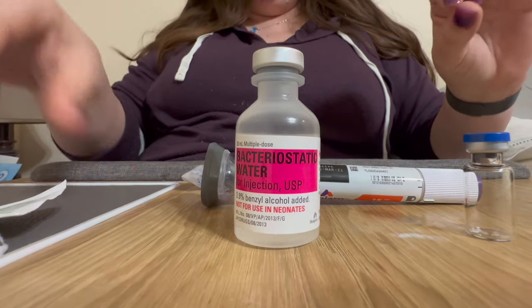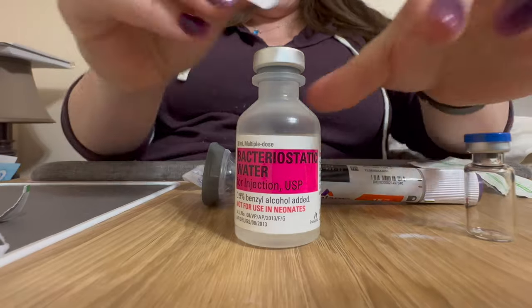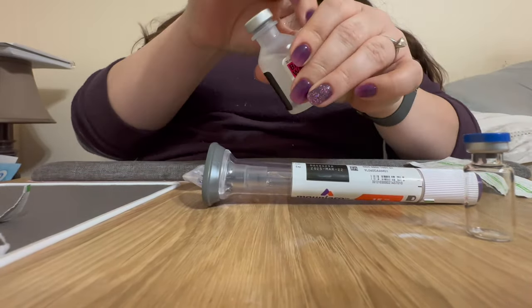Before you do anything with these vials, I've got another alcohol wipe and I wipe down the top of this.